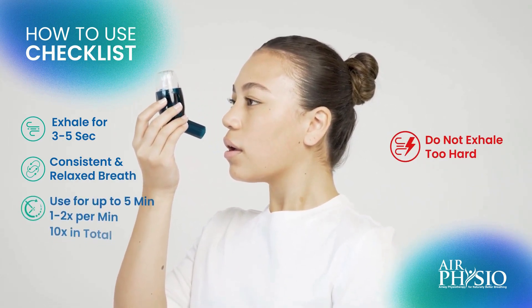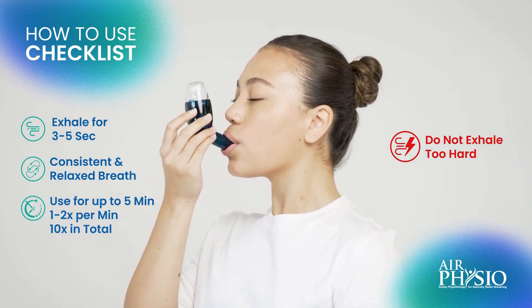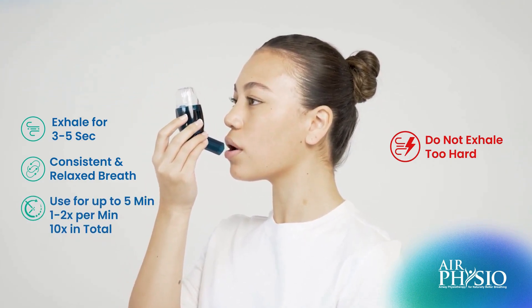Use the device up to 5 minutes, 1-2 times per minute. The aim is to use the device 10 times in total.